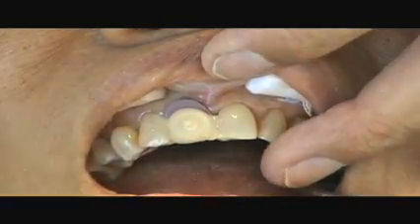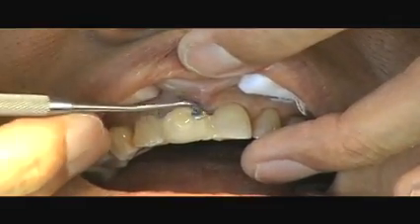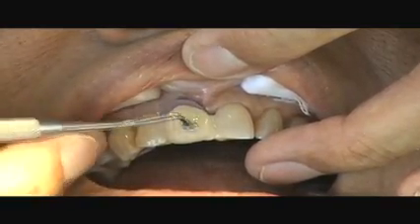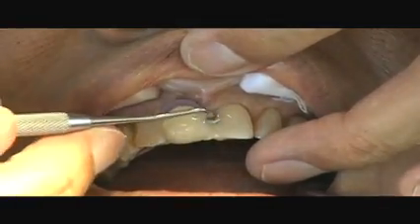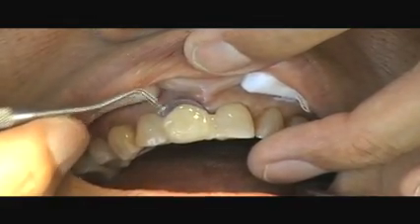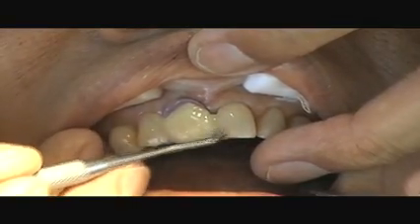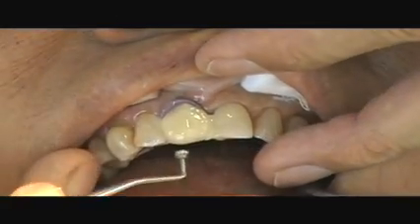Now that the substructure and attachment wings are secure and of sufficient bulk, a glossy finishing composite is applied to the mid-portion of the pontic number 8 and smoothed and contoured to the various surfaces of the pontic. Care is taken to maintain thickness consistent with the lateral and central abutment teeth, and envision the facial curve of the anterior sextant.